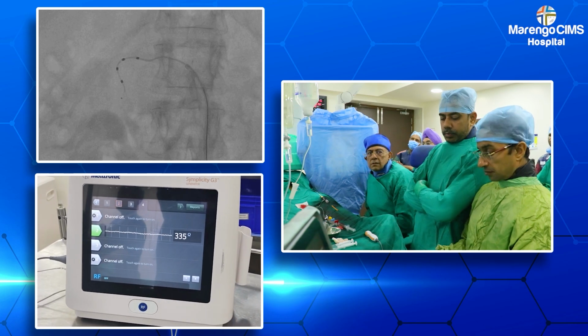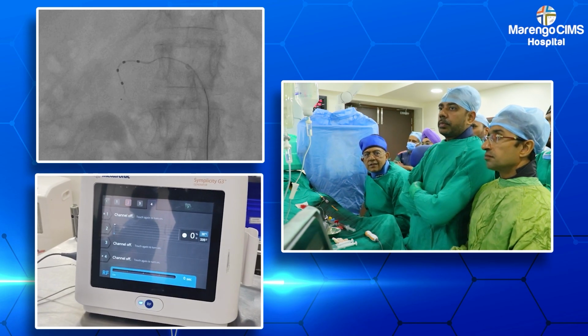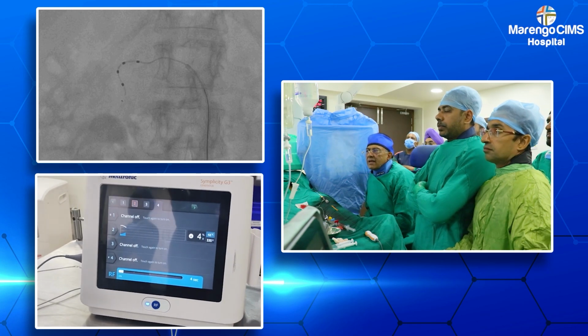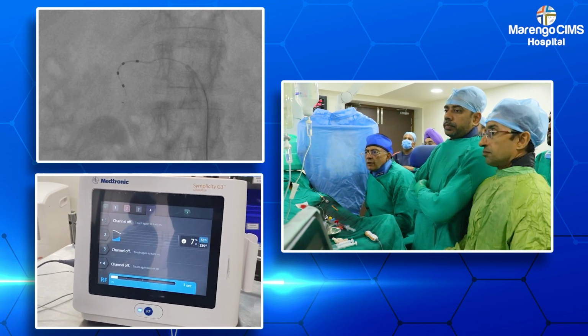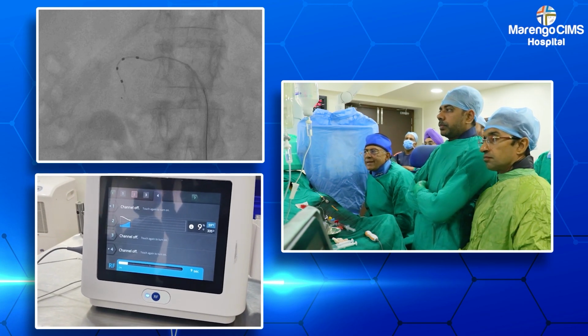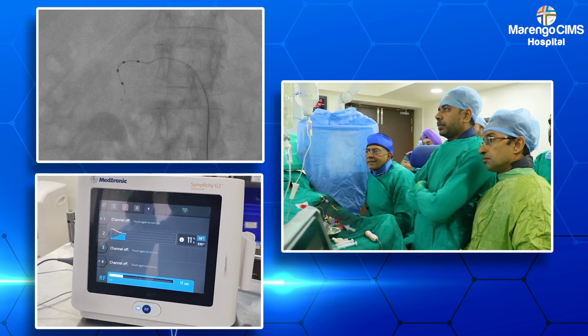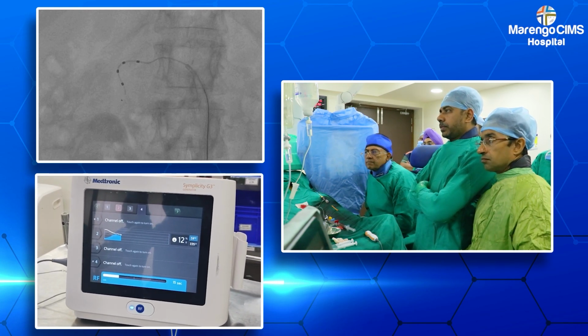Experience of using this catheter over the last few months across the world has made people realize that as many unablated areas as possible should be ablated, instead of the original concept of ablating only 2, 3, 4 places.